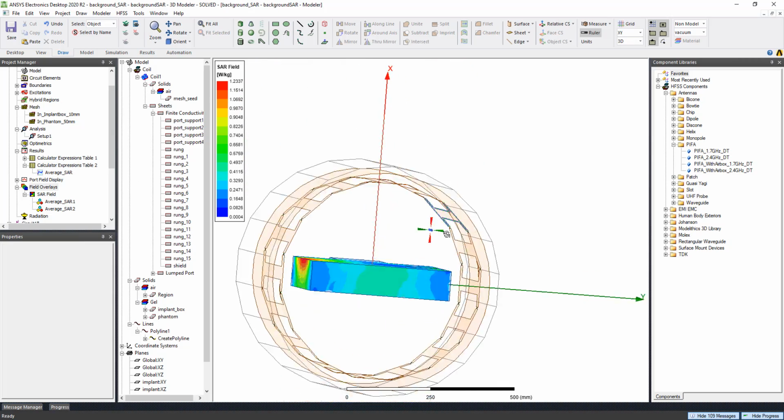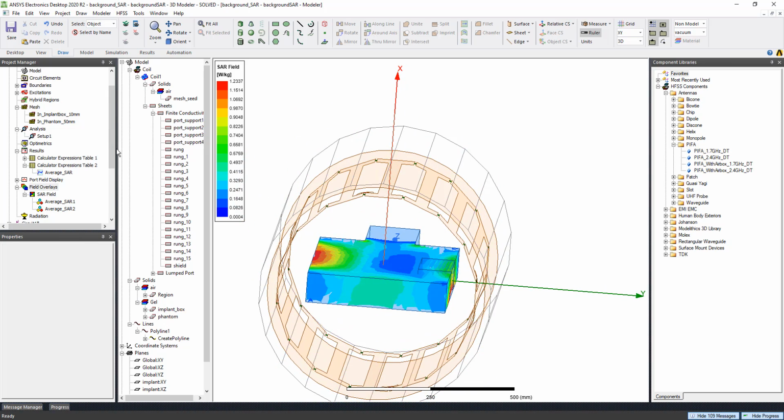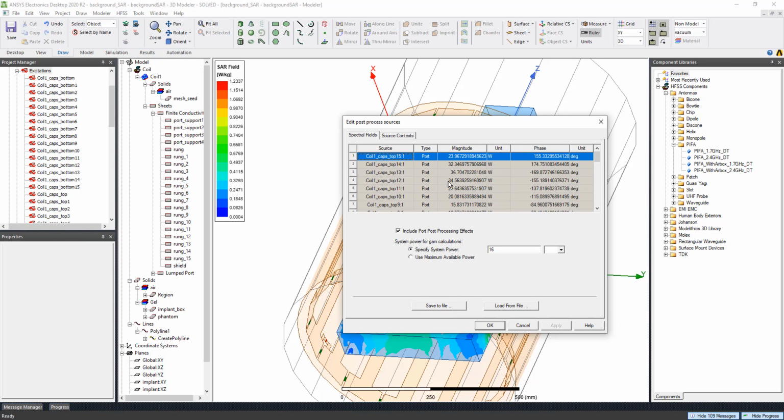So what was coming next is, last but not least, another magic about HFSS: you can change the excitation. You can right click excitation, edit source, and here you can change the power of input. I think here we have 4 watts, 4 watts, 4 watts, 4 watts. These are the values that were pushed from our circuit, but you can always change it here. Let's say you have 0 for all the others, and you can change the power input here.